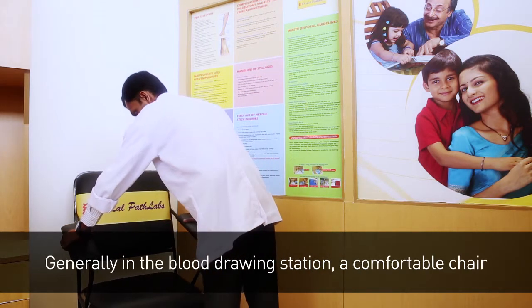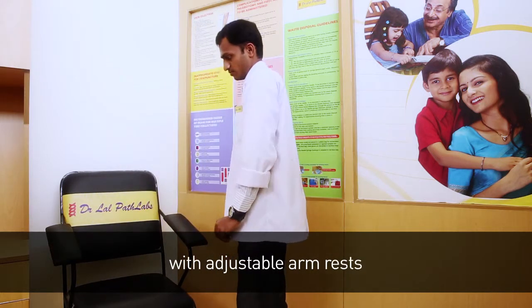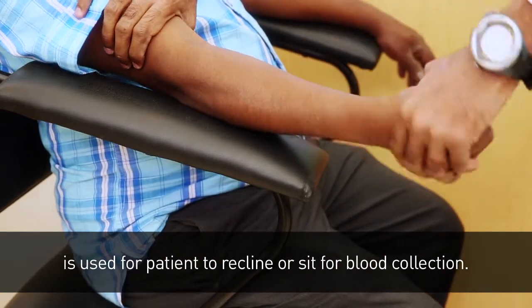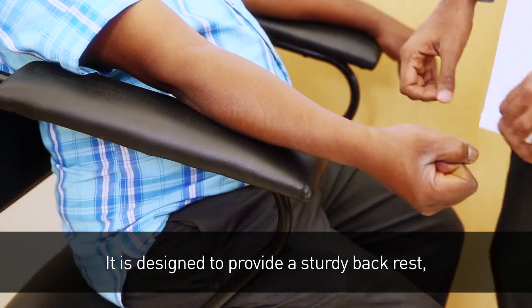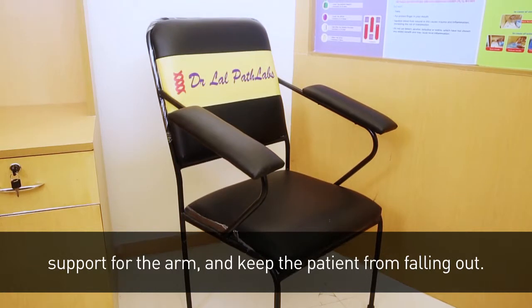Generally, in the blood drawing station, a comfortable chair with adjustable armrests is used for the patient to recline or sit for blood collection. It is designed to provide a sturdy backrest support for the arm and keep the patient from falling out.